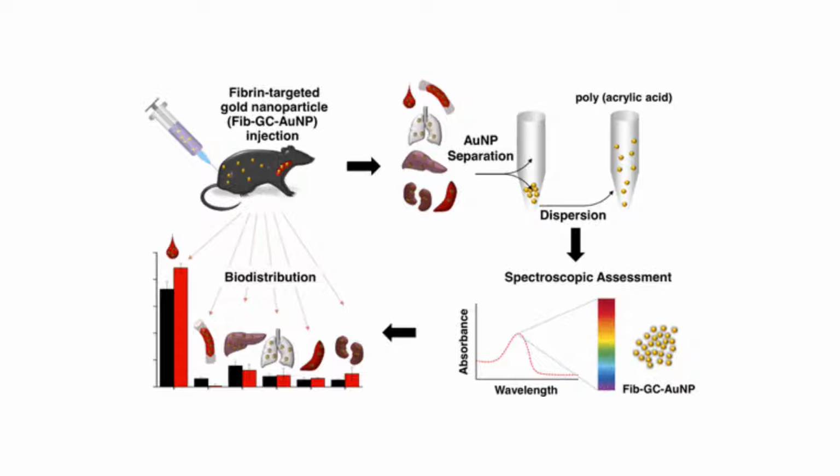Apart from whole body imaging, you can also isolate these organs after sacrificing the animals. In whole body imaging, the organs are over one another, so you will not be able to tell the exact location of the organs. But if you isolate these organs, you can do ex vivo bioimaging of them.